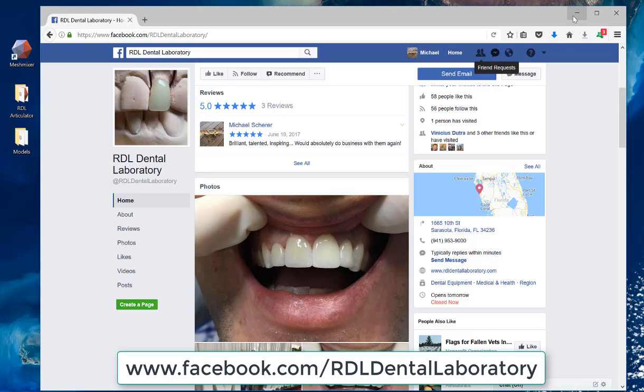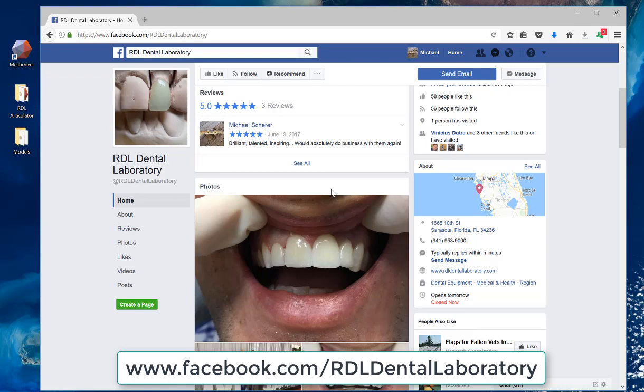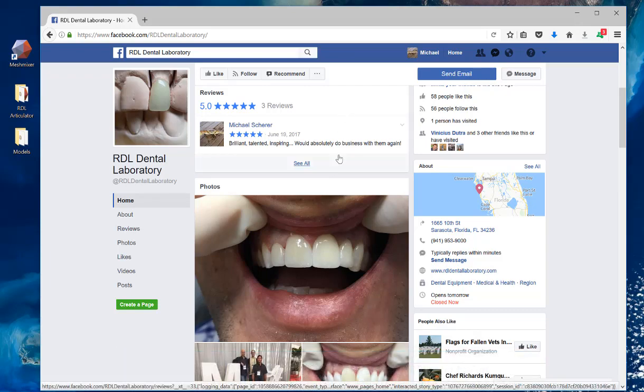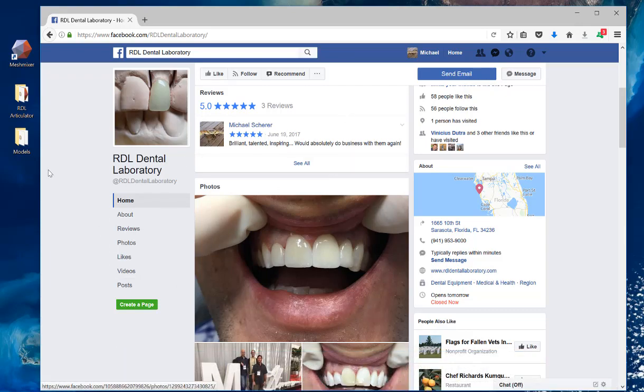He said, I wonder if I can do a CAD drawing of an articulator and then be able to 3D print that using a Formlabs printer or whatever printer he's got. He came up with this really cool idea of a virtual articulator. So he reached out to me, and I thought this was a bananas idea. We've been working on this project, getting it ready to release, and we've got it ready for you. In this video, we're going to show you how to work with this file. He put a ton of work into this design, and he's only charging $10 for these STL files. It's basically giving it away. So contribute $10, and if you want, send Seth some cases as well. He's an incredible resource.